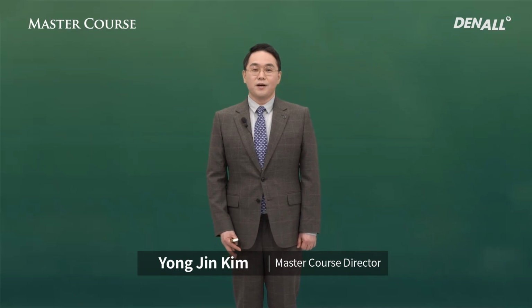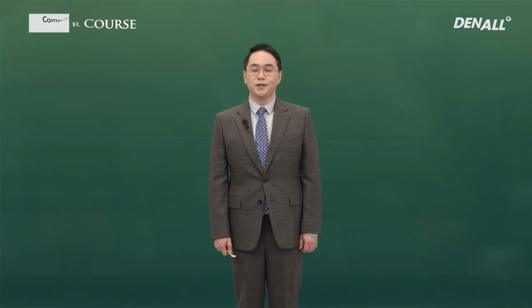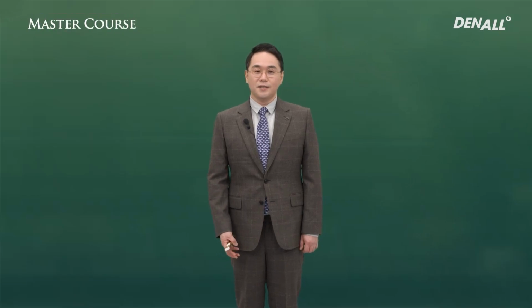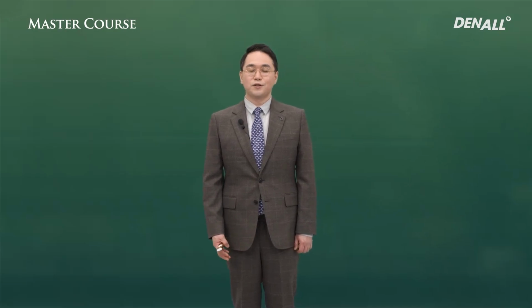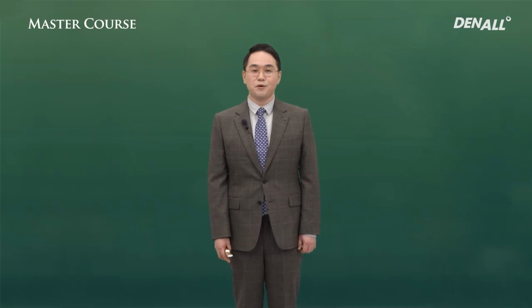We provide implant treatment to deliver ideal prosthesis on the alveolar bone. For ideal prosthesis, you need to place the implant well. How can you place implant well? There can be many different ways, but as of late, the most popular is the digital guided surgery. When digital guided surgery is used, even beginners can place implants in good position and good depths, and that is the cause of its rising popularity.